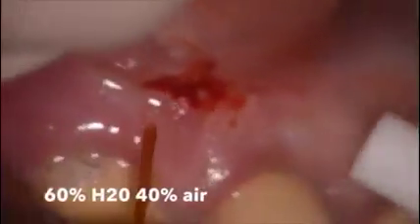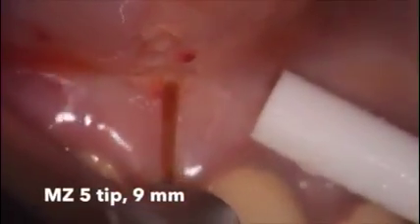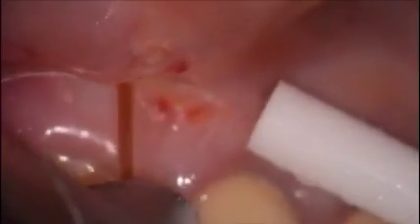Pulling on the lip — that's the key — with your left hand. If you're holding the handpiece with the right hand, pull with your left hand, and in doing so you're able to release the fibers and gain greater movement of the upper lip.